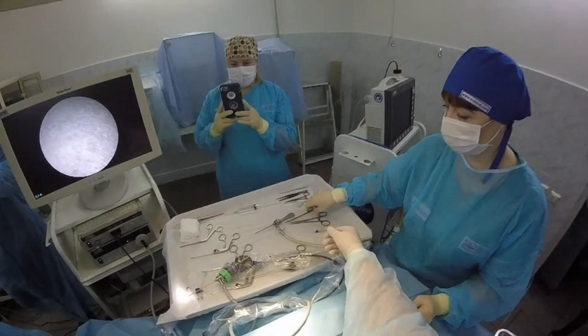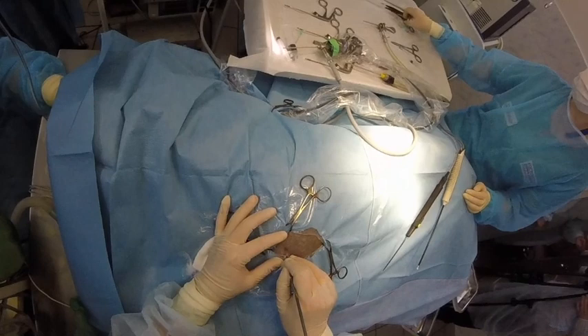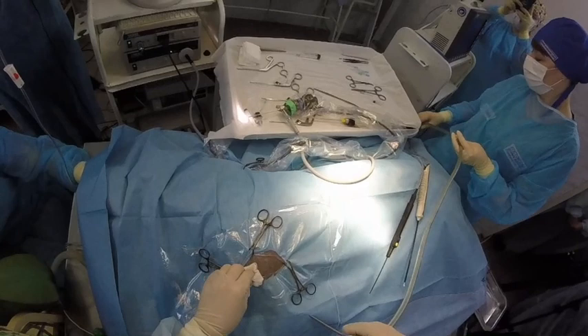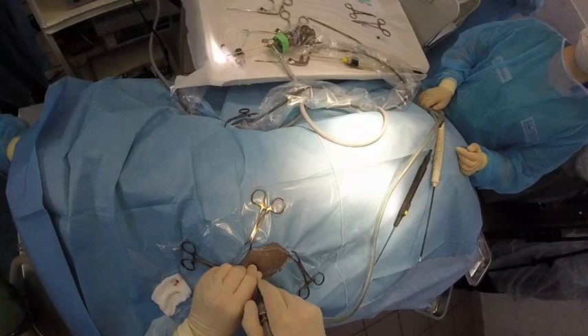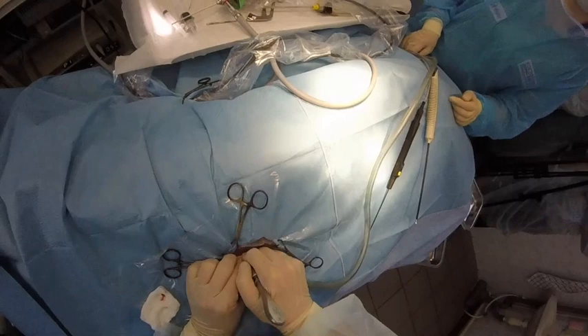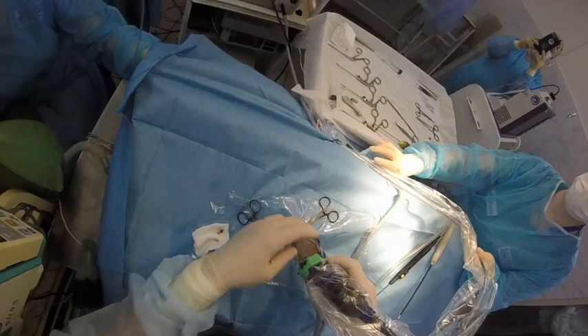Give me a scissor please. Find the acromion, perform the incision, then pull. Take the sheath with blunt stylet and insert into the joint. As you see, we find fluid. Insert into the joint.